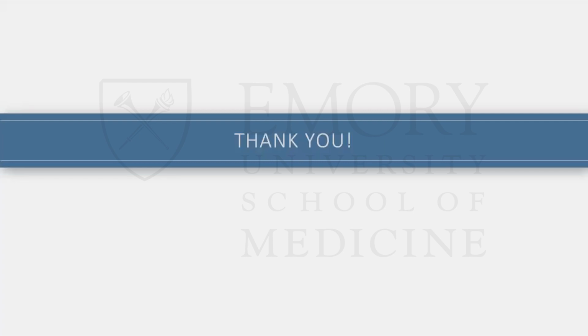Yeah, I totally agree with that. One of the changes I noticed after I started researching this was that I felt more empowered to not report a diastolic grade for more echoes, because there are so many times where it really doesn't work, and you're not going to be helping whoever ordered the study or the patient by taking a guess that doesn't apply. So yeah, I totally agree with that.